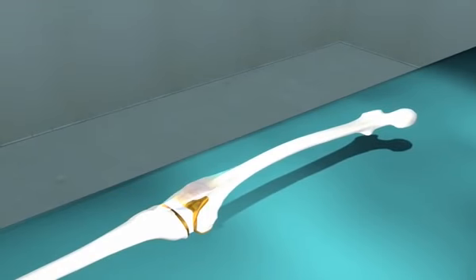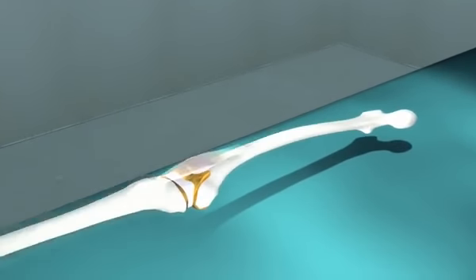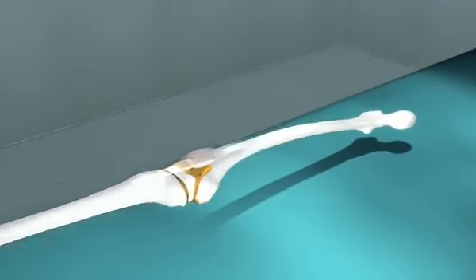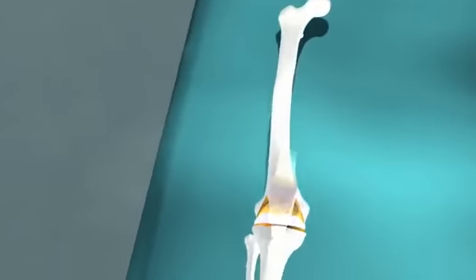Now that all components have been completely installed, they are checked for range of motion, and any impinging tissues should be removed at this time. A full active range of motion without any patella subluxation should be the final observation following correct installation of all components.